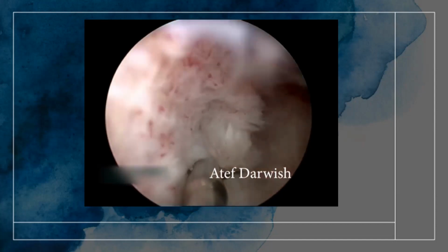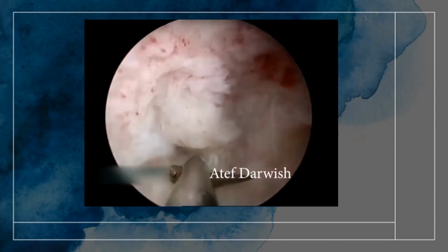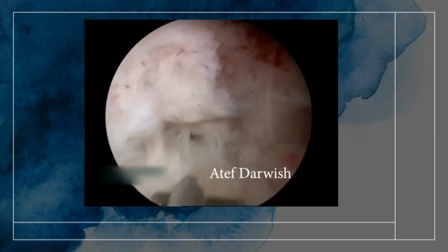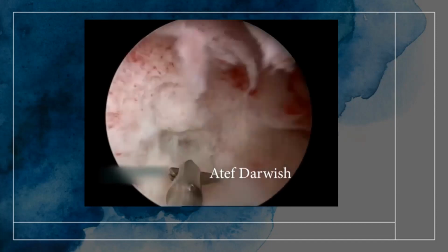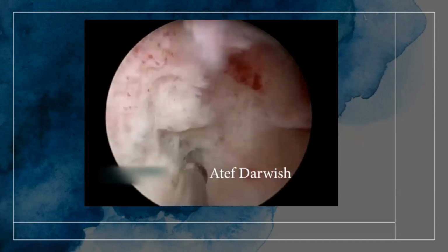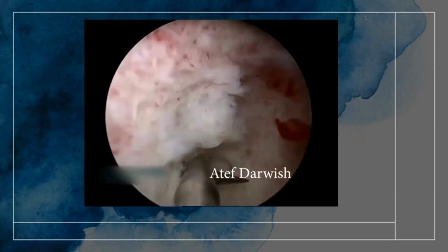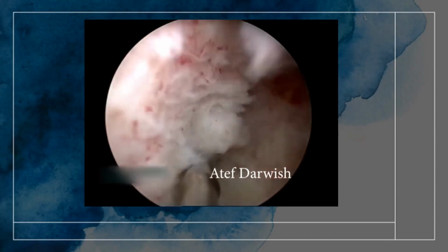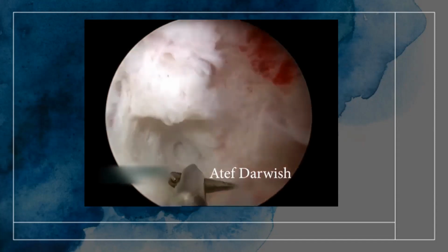So you have to introduce a delicate instrument here, which is microscissors. If you use the resectoscope, this is not recommended because it will destroy the tubal ostium and the intramural part of the fallopian tube, so you will lead to an occlusion of the fallopian tube by an iatrogenic approach. So you have to use a delicate instrument, which is microscissors.